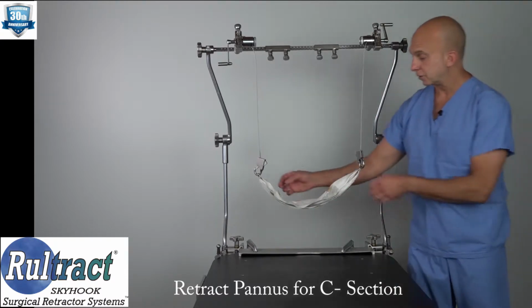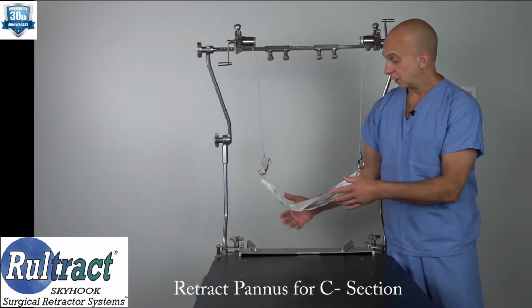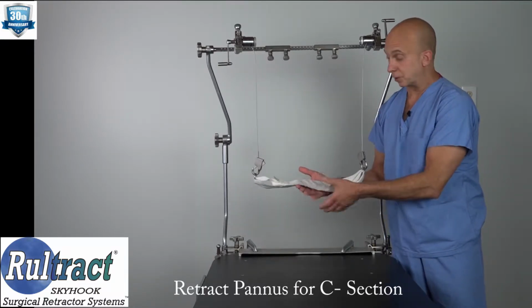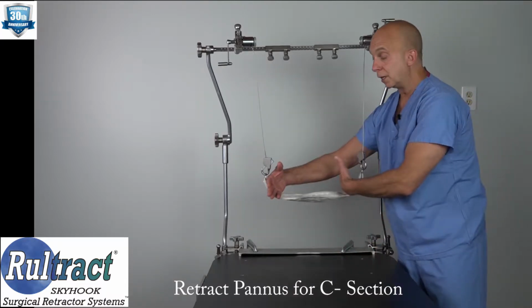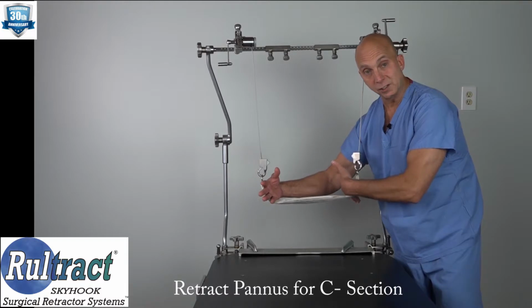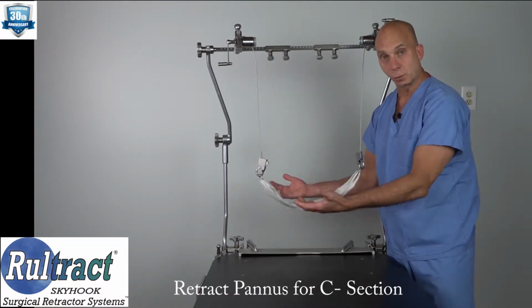Now what I have here is just some type of a sling. Not really even sure where I got it. We can come up with something, though I'm sure you have something similar to this. What I'm thinking is to take the pannus and to possibly lay it into the sling, which would keep the pannus off of the patient's chest or face.